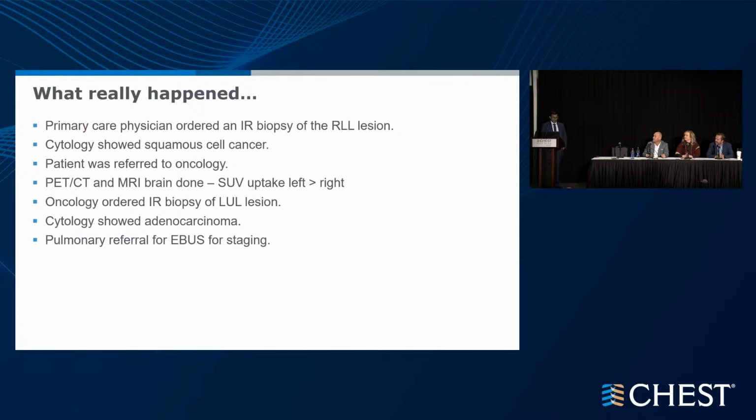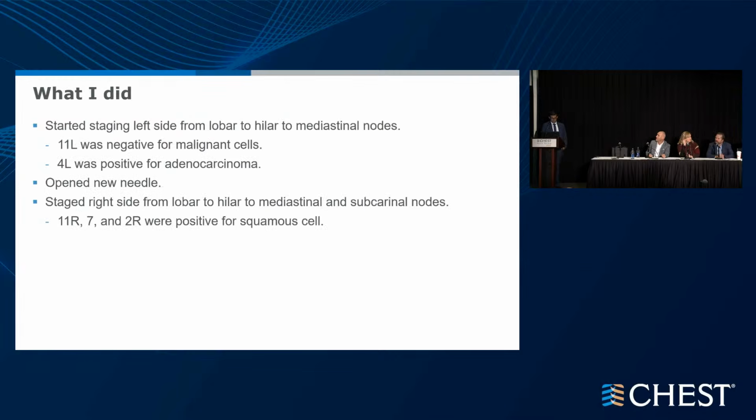So what's the mediastinum? All right. The mediastinum showed the left 11L was negative for malignancy, 4L was positive for adeno. So we got a new needle, just because the left side was much more PET avid, so I was presuming it was going to be something different on the right. And 11R, 7, and 2R were all positive for squamous.